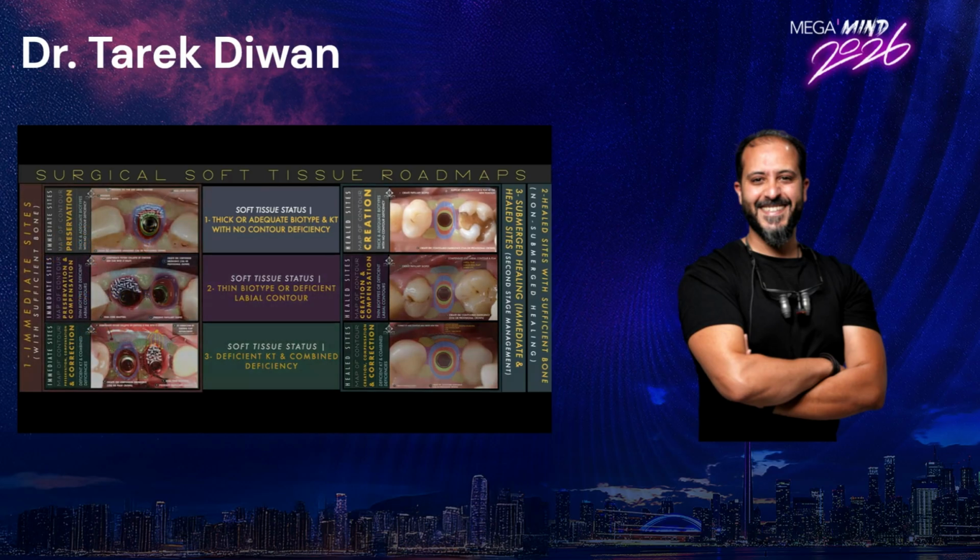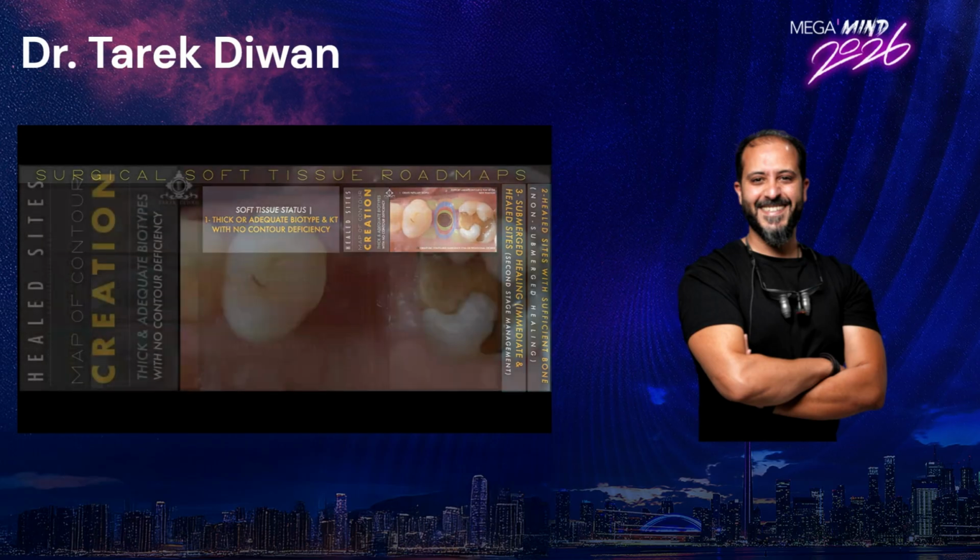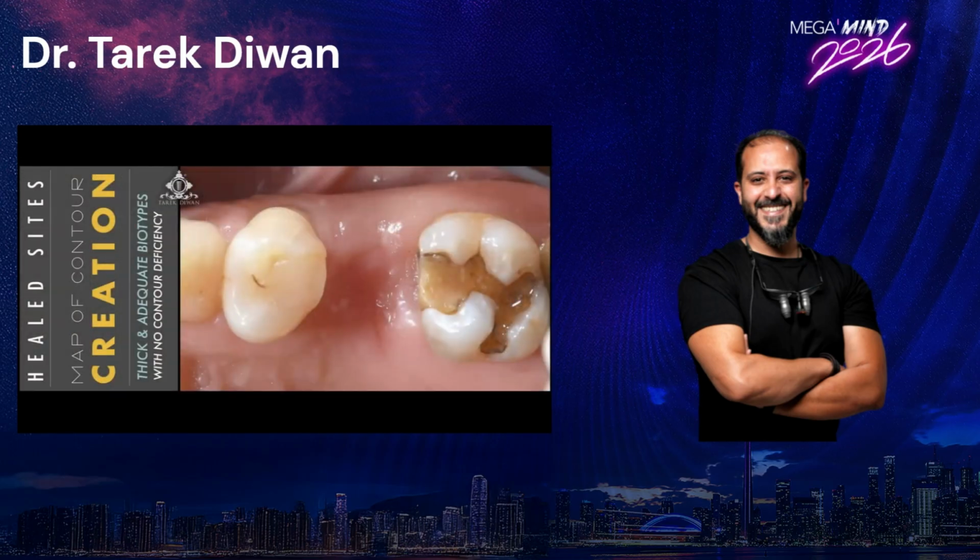Out of all the protocols, let's start with the cases of the thick or adequate biotypes and keratinized tissue with no contour deficiencies. In such cases, we follow what we call the map of contour creation. We start with no qualitative or quantitative tissue deficiency, and we need to create an emergence profile following the EBC contour concept with a customized healing abutment placed on top of the implant on the same day of the surgical placement, or on the second stage procedure using a provisional crown that will help me push back the papillae in place, and support the labial contour and the free gingival margin at the new position.